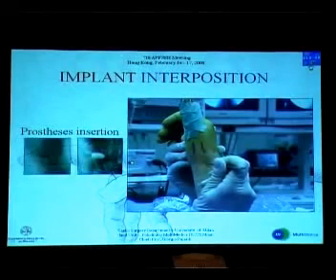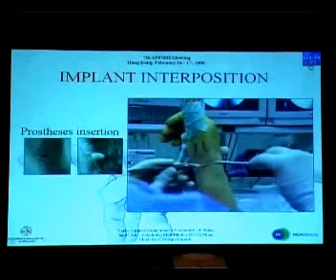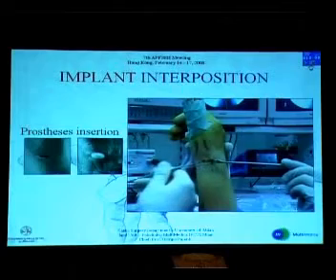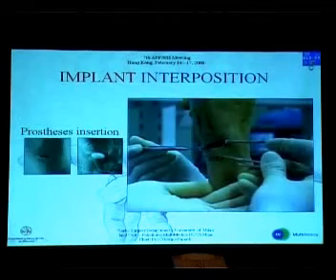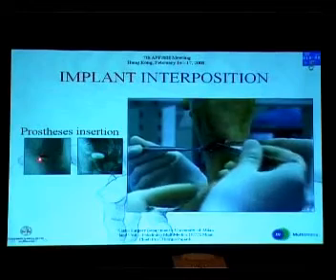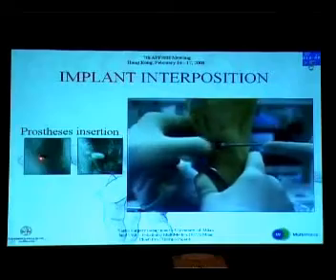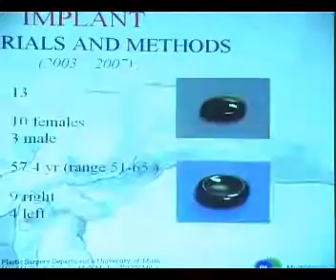In the patients where the STPI pyrocarbon prosthesis was positioned with the help of arthroscopy, after the distal pole resection, the two portals were united and the prosthesis was positioned. It's very important to try, if possible, to leave a little peak from the radial dorsal part of the scaphoid, to create a bit of obstacle against potential subluxation of the prosthesis. This is the intraoperative testing without traction.